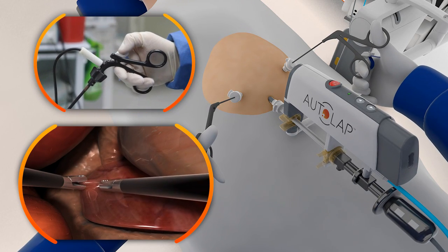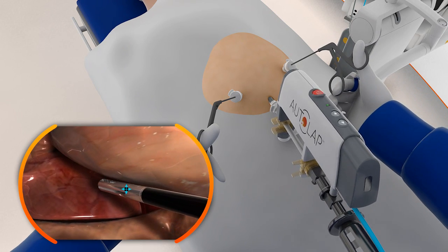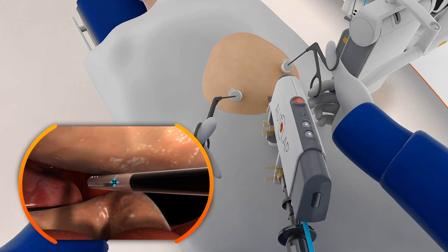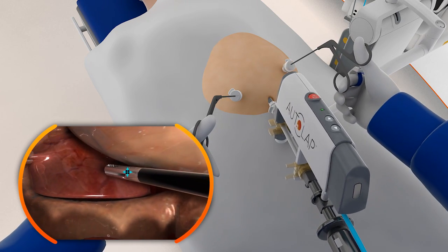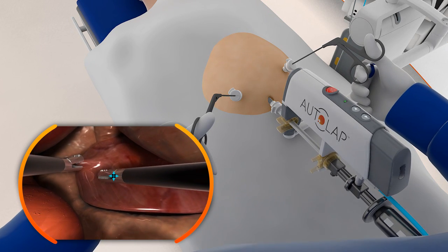Using the control unit, the surgeon virtually tags the desired instrument on the video monitor. The positioner automatically follows the surgeon's instrument, continuously repositioning the field of view in a stable, synchronized, and precise manner with the surgeon's full control.